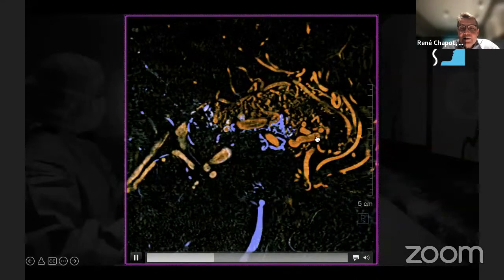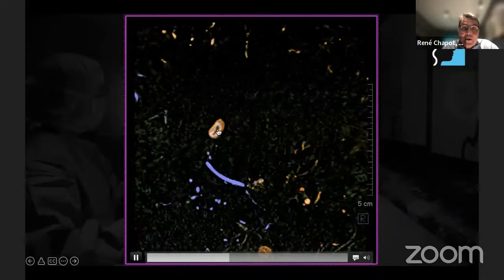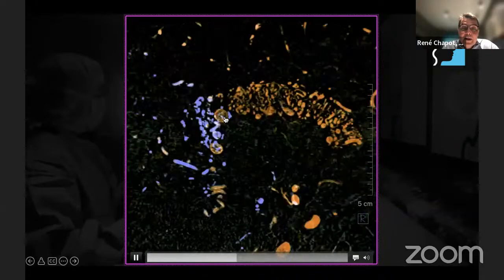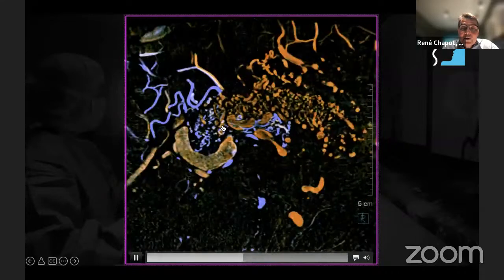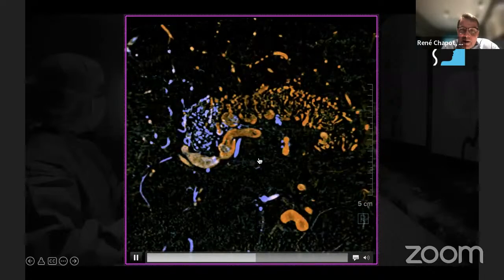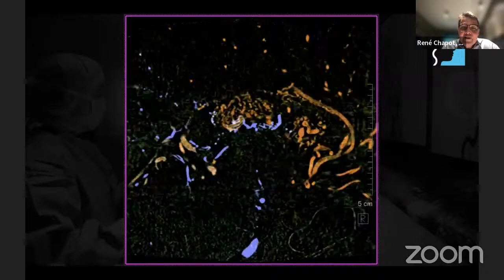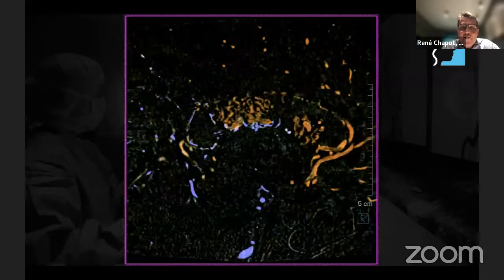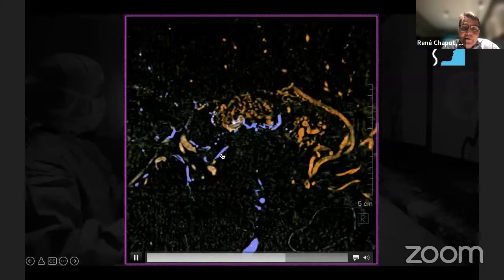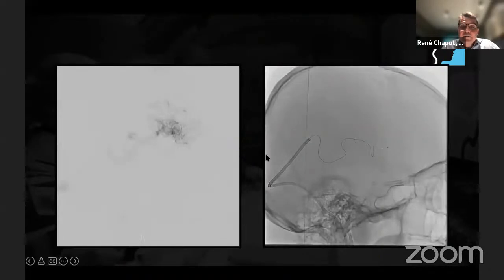Here's the anterior vein that is going up to there, but we see also here another posterior vein, this one that goes up there and that drains all this part. So because of this, we can analyze properly the venous segmentations. How do all primary veins come together to get inside the main vein? And this gives us the key to further go on here with a staged transvenous approach.